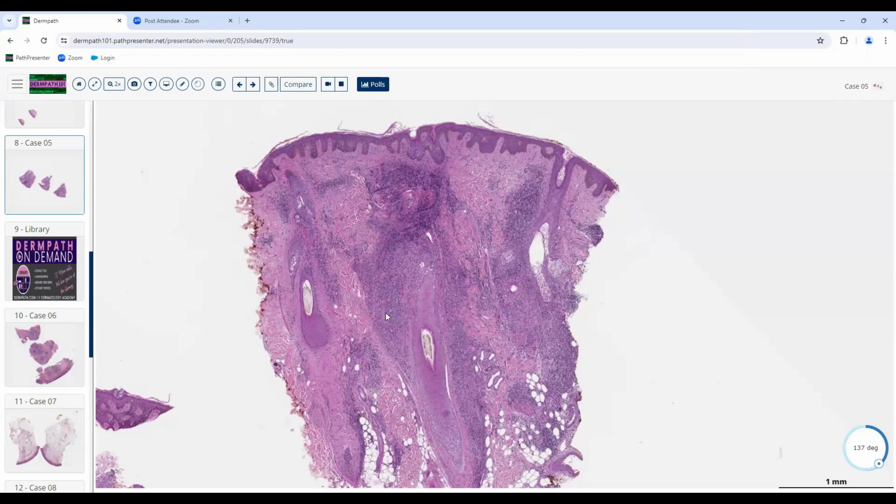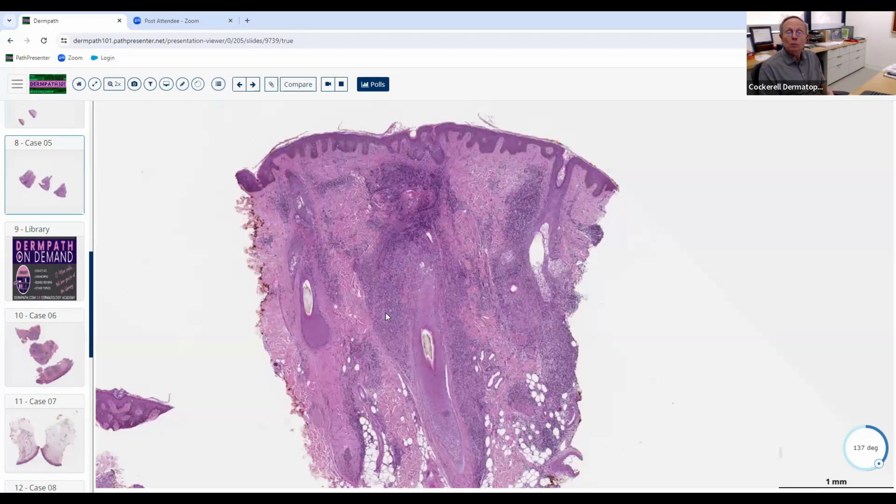We sometimes see the differential diagnosis of lichen planus and lupus erythematosus clinically. So the dermatologist will biopsy a person with alopecia and send it as LPP versus DLE. And occasionally we see this pattern, and so we sometimes call that maybe an overlap between lichen planopilaris and discoid LE. They can sometimes look kind of similar.